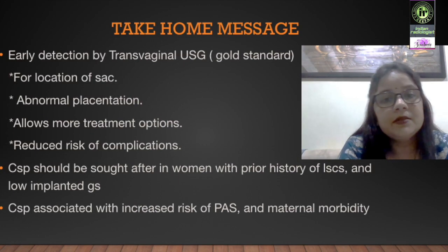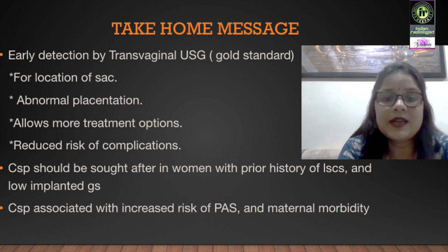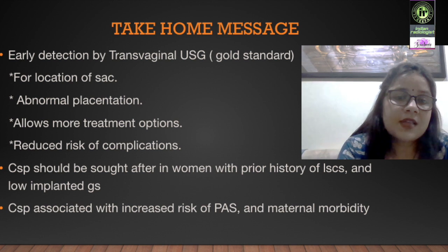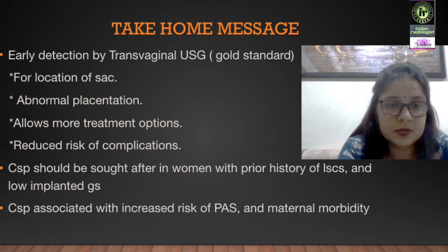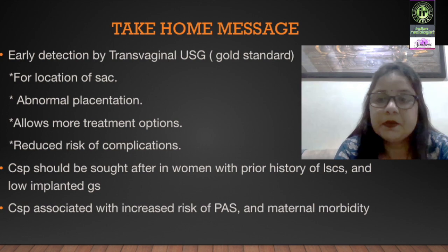So finally, the take-home message is early detection by TVS is the gold standard for management of CSPs, for location of the sac and for abnormal placentation, allowing more treatment options and reducing the risk of complications. CSP should be sought after in women with prior history of LSCS and low implanted gestational sacs, and CSPs are associated with increased risk of PAS, that is placenta accreta spectrum, and maternal morbidity.